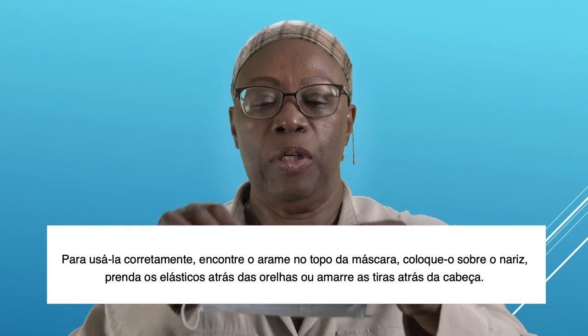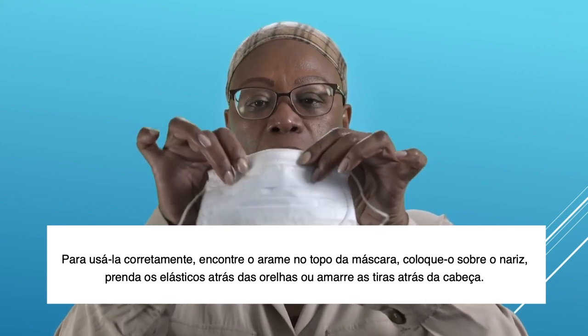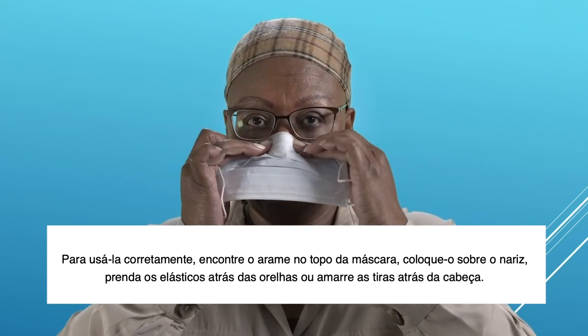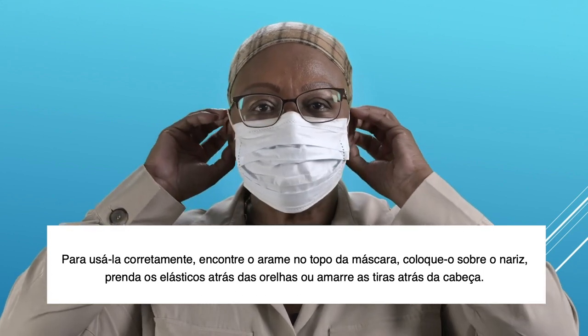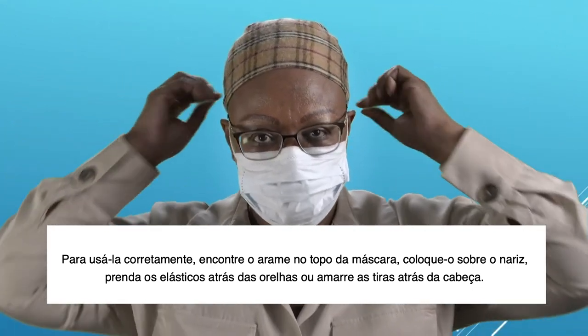To wear it correctly, you should locate the metal strip at the top of the mask, place it over your nose bridge, and secure the elastics around your ears or tie the strings behind your head.